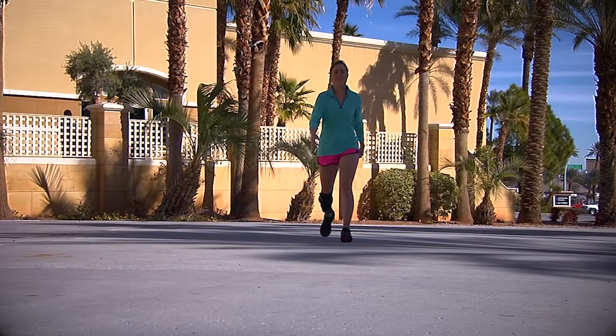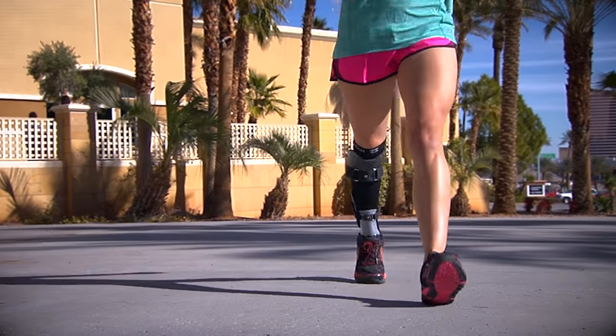Just being able to step down with your body weight and not have pain — that was like that day when I first put it on. You should see me go now. It's changed my whole life.